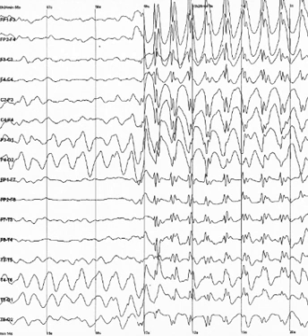Derivatives of the EEG technique include evoked potentials (EP), which involves averaging the EEG activity time locked to the presentation of a stimulus of some sort, visual, somatosensory, or auditory. Event-related potentials (ERPs) refer to averaged EEG responses that are time-locked to more complex processing of stimuli. This technique is used in cognitive science, cognitive psychology, and psychophysiological research.